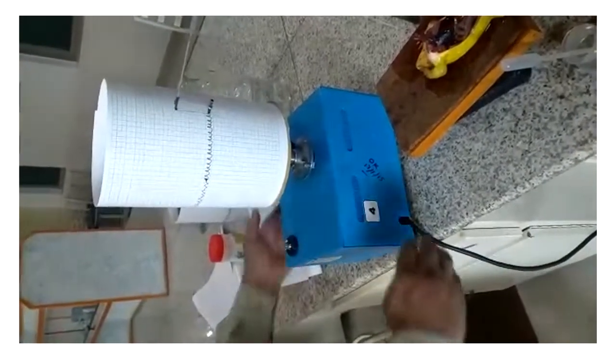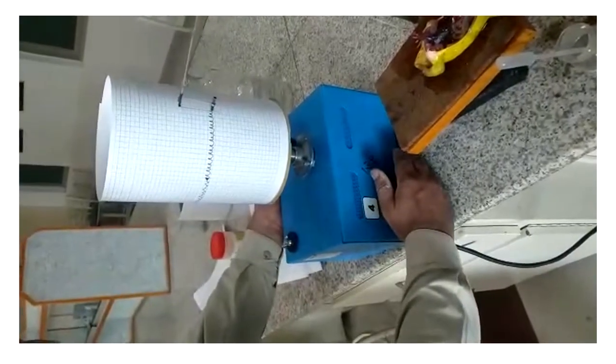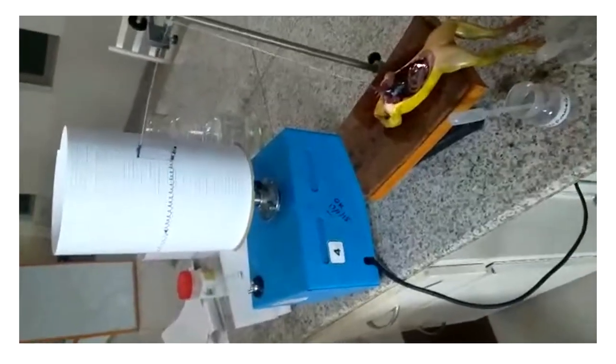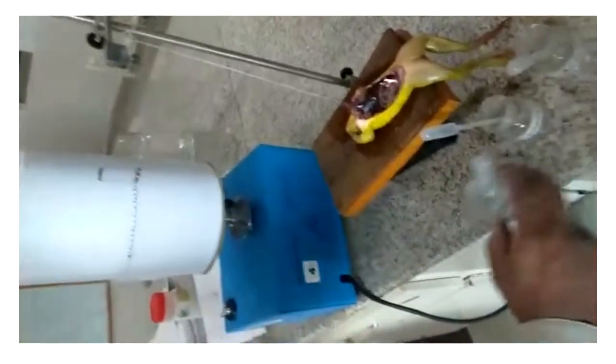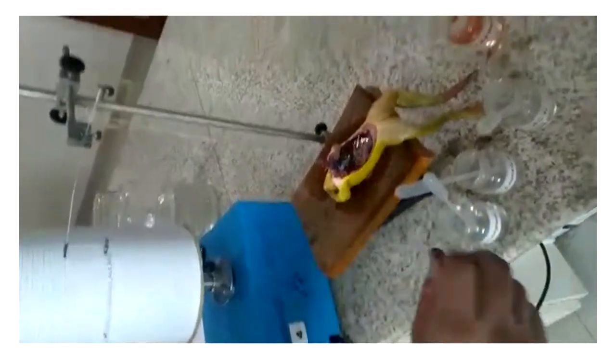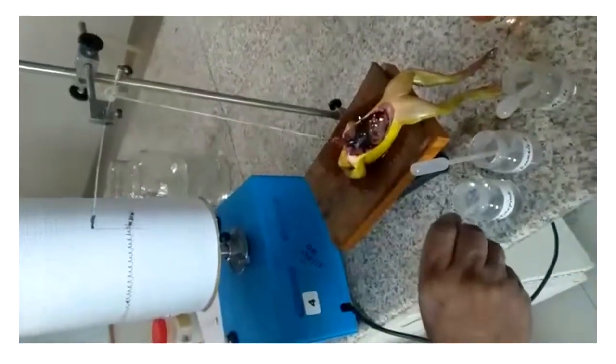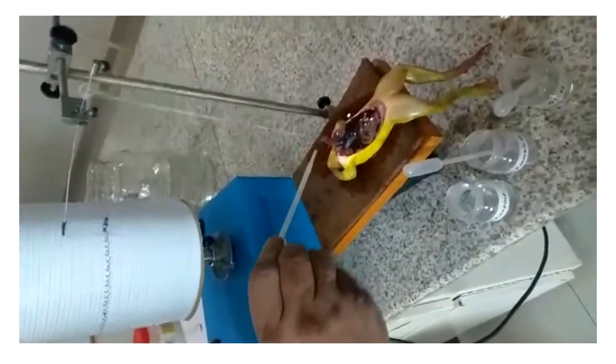Stop. Now we will add atropine. And after that, without washing, we will add acetylcholine.